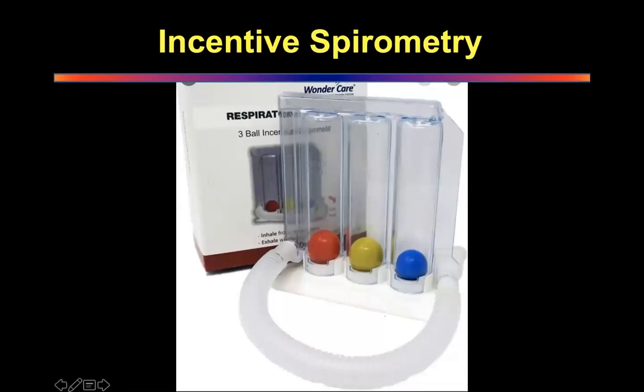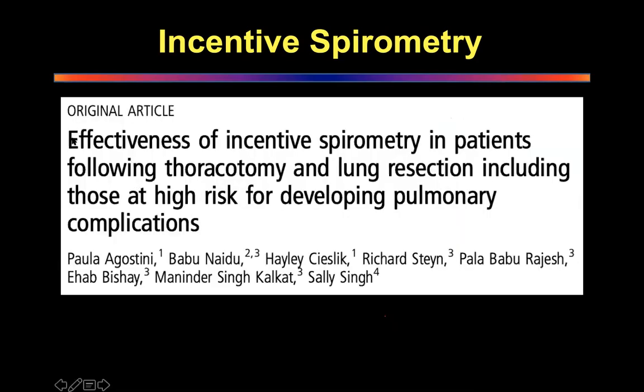Incentive spirometry is used quite aggressively in India and other countries. I've seen this. It allows patients to do physiotherapy exercises and allows them to cough up all the phlegm and things like that. But there's a very nice paper, a really well-done, well-written study, which has looked at the effectiveness of incentive spirometry.